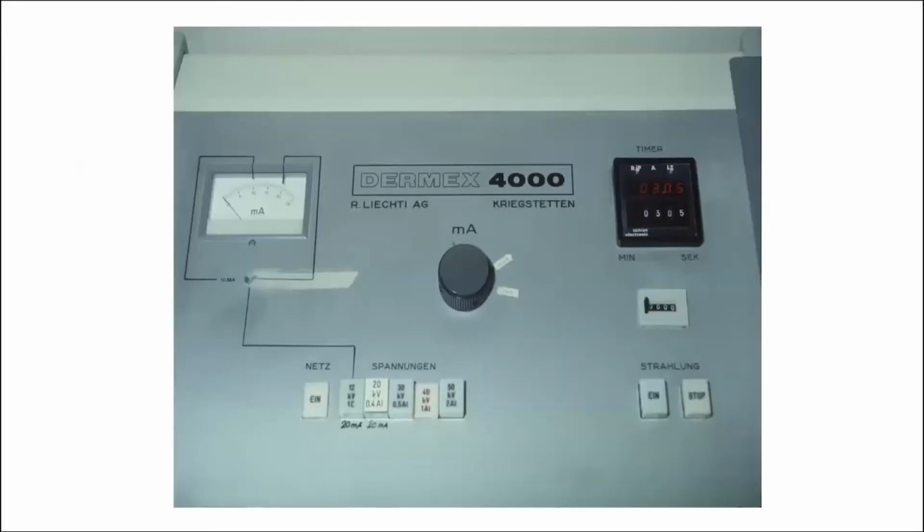So I show you here a picture from our old machines that we have used earlier. I like this machine because everything is so simple. It always has a fixed combination of the voltage and the filter applied, which is, for example, aluminum for the 20 kilovolt. And also you see here the connection with the current and the counter for the treatment duration.